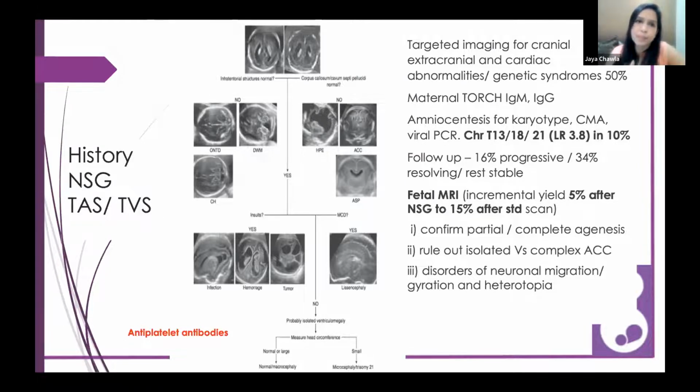In the infratentorial compartment, you've beautifully seen in Dr. Tina's videos that there can be evidence of open neural tube defects, along with an issue with posterior fossa formations leading to the Dandy-Walker spectrum. So we need to look at both ends of that spectrum and see further.